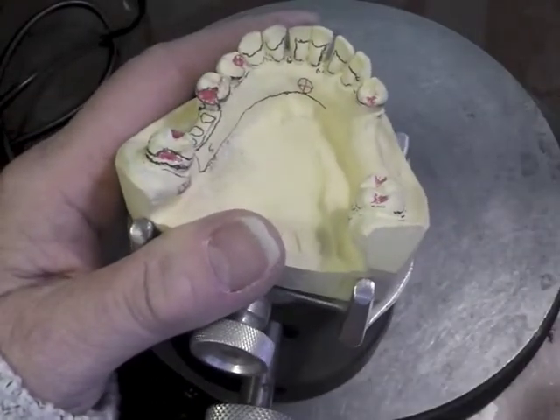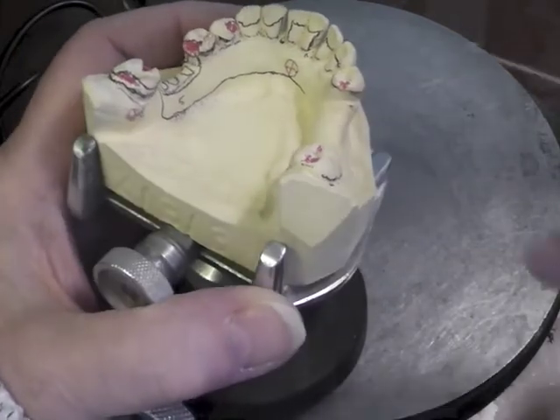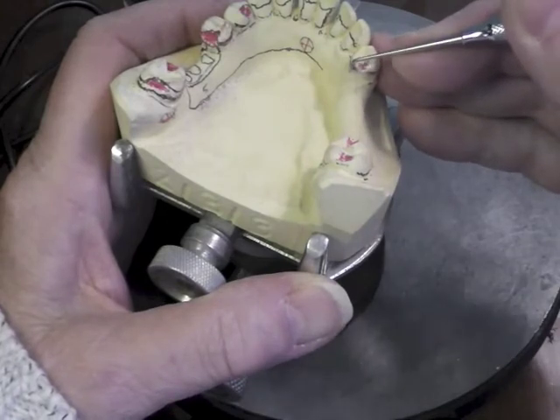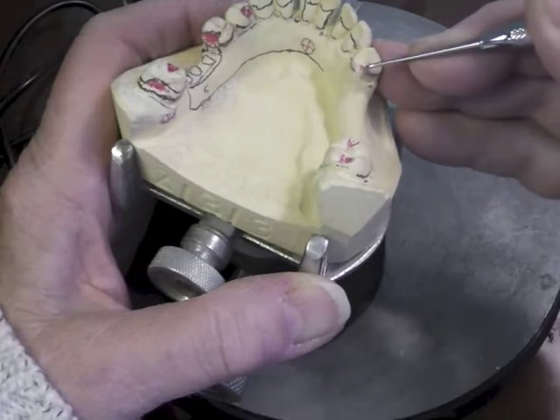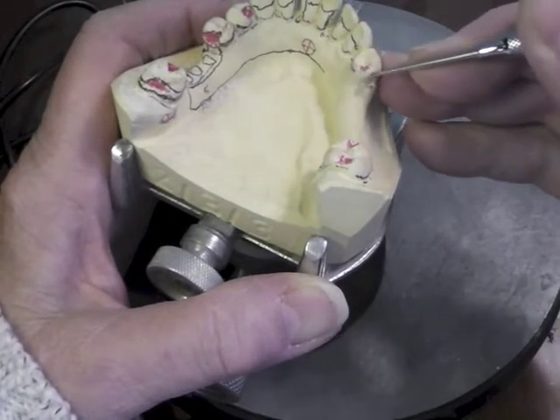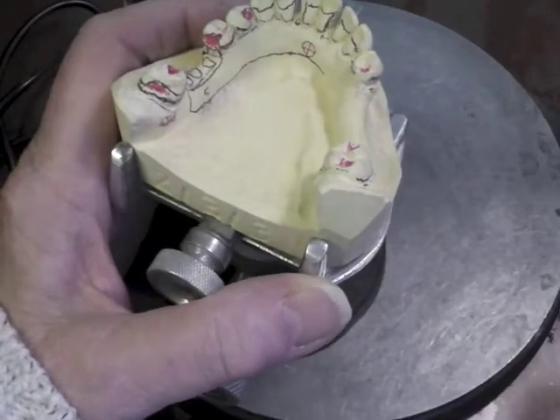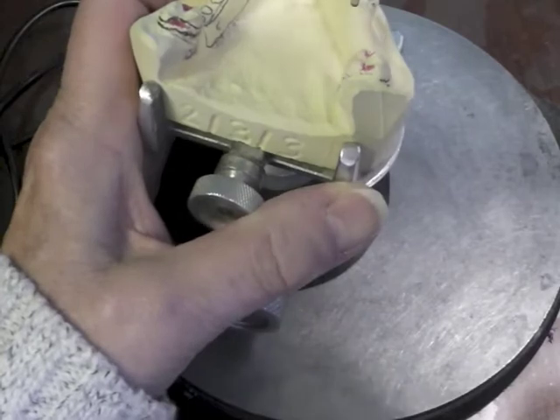As we come over here, we've got to prepare this particular rest right here. Again, I have a very high survey line, so the first thing I want to do is prepare my guiding plane so that I can have parallel guiding planes. I'm going to lower that survey line preferably to at least three millimeters below the marginal ridge. I'm going to re-survey it to make sure that I did achieve that, and I have.